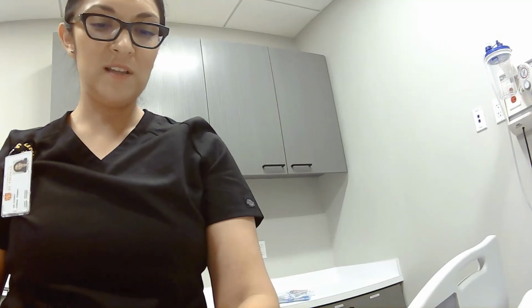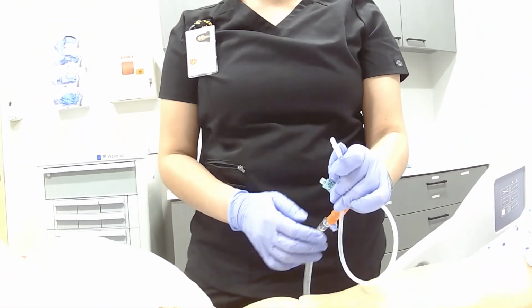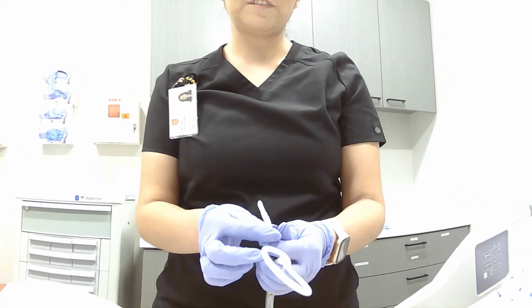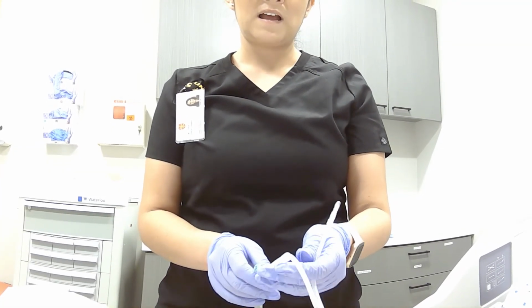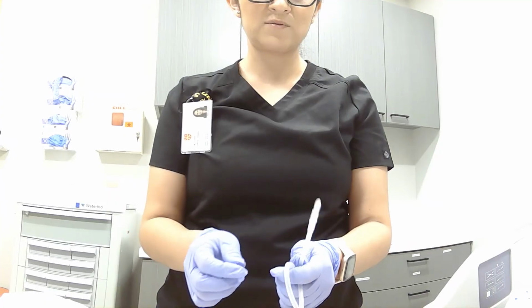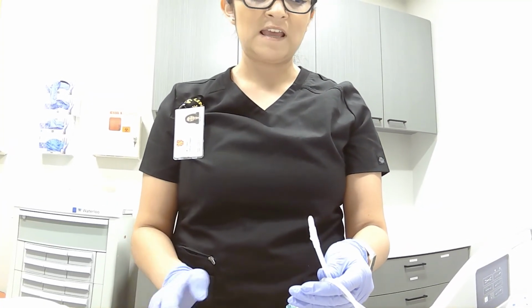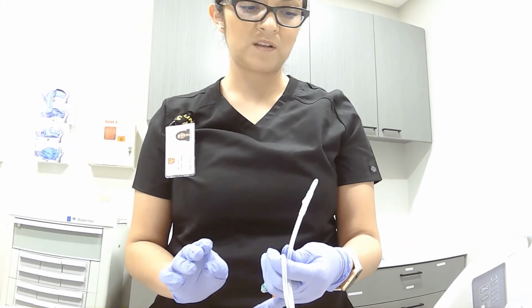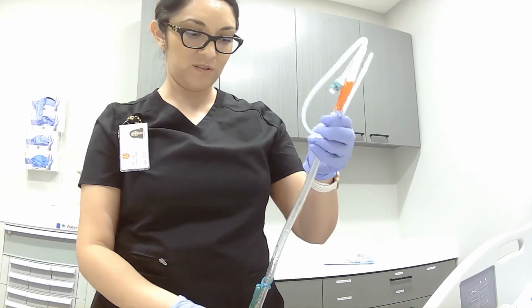Okay, so it looks intact. The patient didn't have any discomfort. We assessed the urine. Then we're going to throw that away. So there was 250 mLs of urine. It was bright yellow, no odor, clear. The clarity was clear, and the amount was 250. The patient tolerated well. There were no complaints, no complications, and everything else will get disposed of.